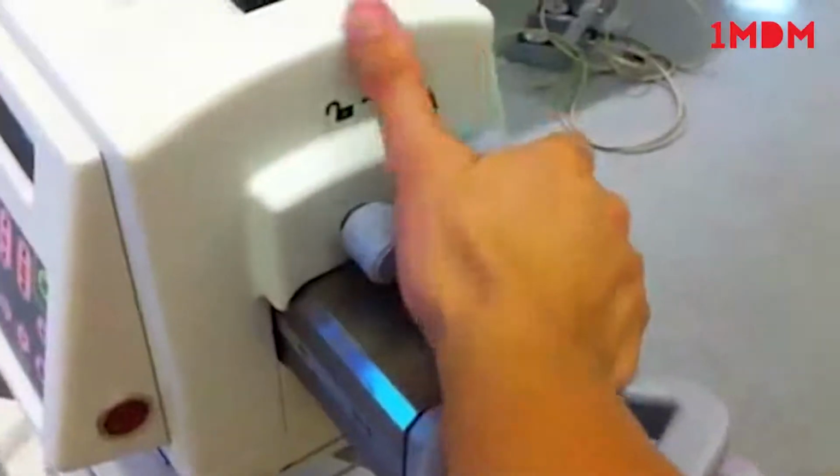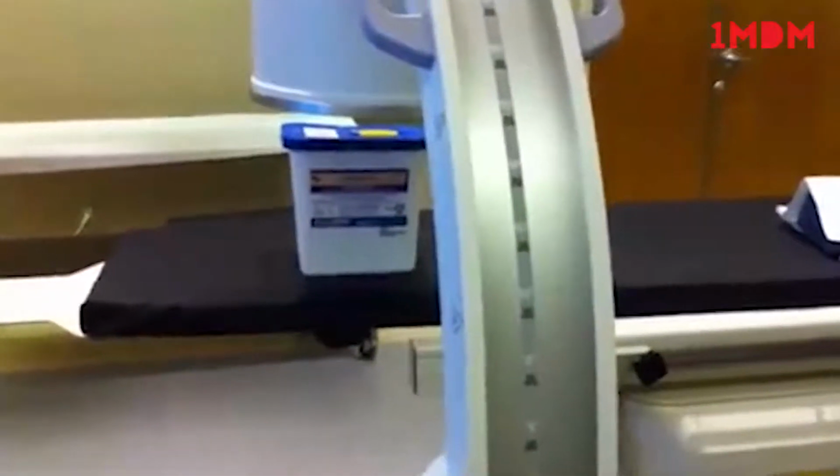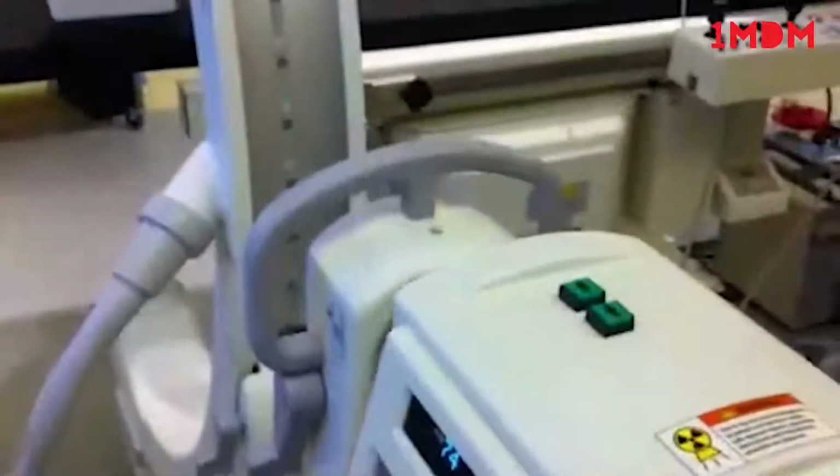And let me just explain the locks here. This lock right here, if you unlock it, flipping it up, you can pull the C-arm, the whole C, in or out, or towards the patient. Let's pull it out into its fully retracted position there. And let's lock it down.